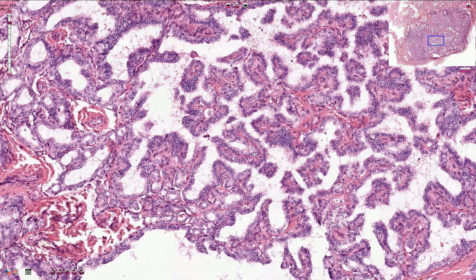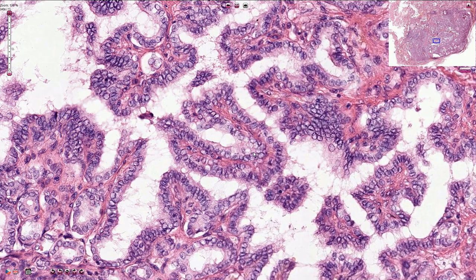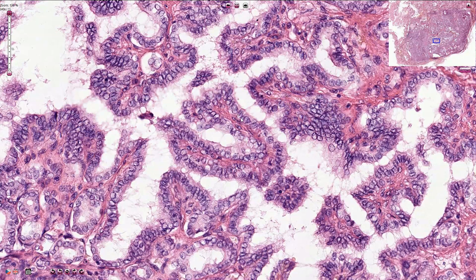At higher magnification, we see that the nuclei are bigger — nuclear enlargement is present. The nuclei are overlapping, crossing one another, and are slightly elongated or oval-shaped, unlike normal thyrocytes. We can also find irregularities of the nuclear membranes, typical longitudinal grooves, and intranuclear pseudo inclusions.